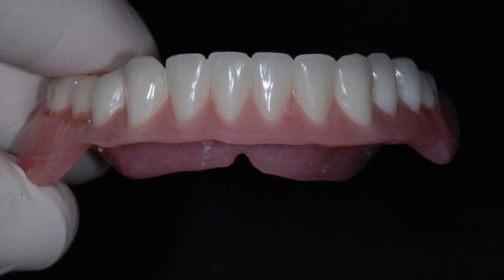Because one of the things we have to correct for is some of the angulation of the abutments. Sometimes we have to seat from the angle of the distal ones first, and then over to the anterior. So a little bit more accessibility in the system when we're doing the final processing makes a huge benefit. That's really smart. If you had five or six more millimeters of acrylic there, you can't see, you're just guessing. That's a really smart idea. Or if they made it in clear acrylic. Yes.